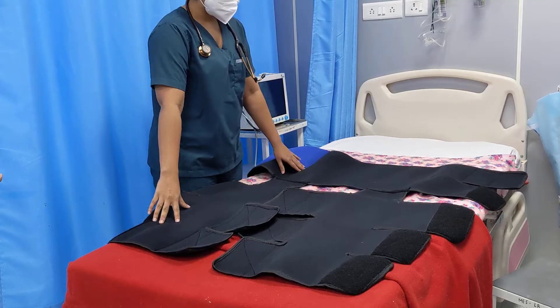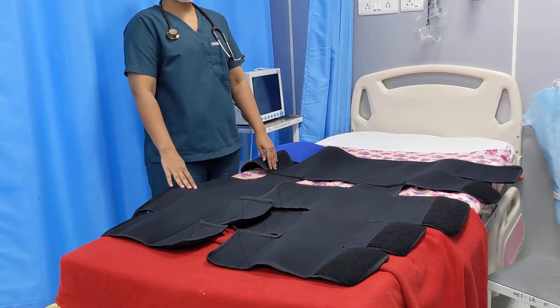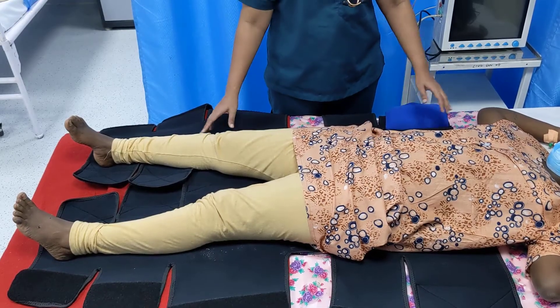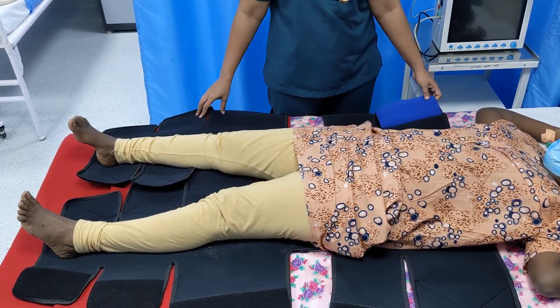We place the garment in a completely open position, and then place the patient in the supine position on this garment. Note that when we put the patient in the supine position over this garment, her spine has to align with the midline of the garment.